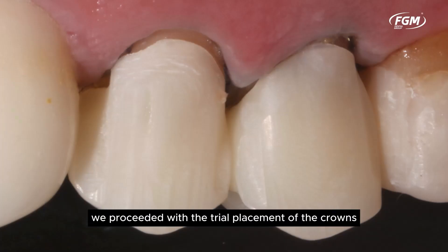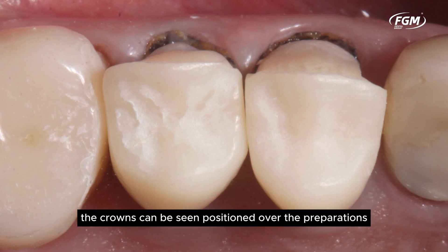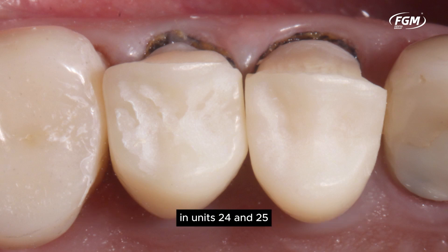We proceeded with the trial placement of the crowns. In the vestibular and occlusal views, the crowns can be seen positioned over the preparations in Units 24 and 25.